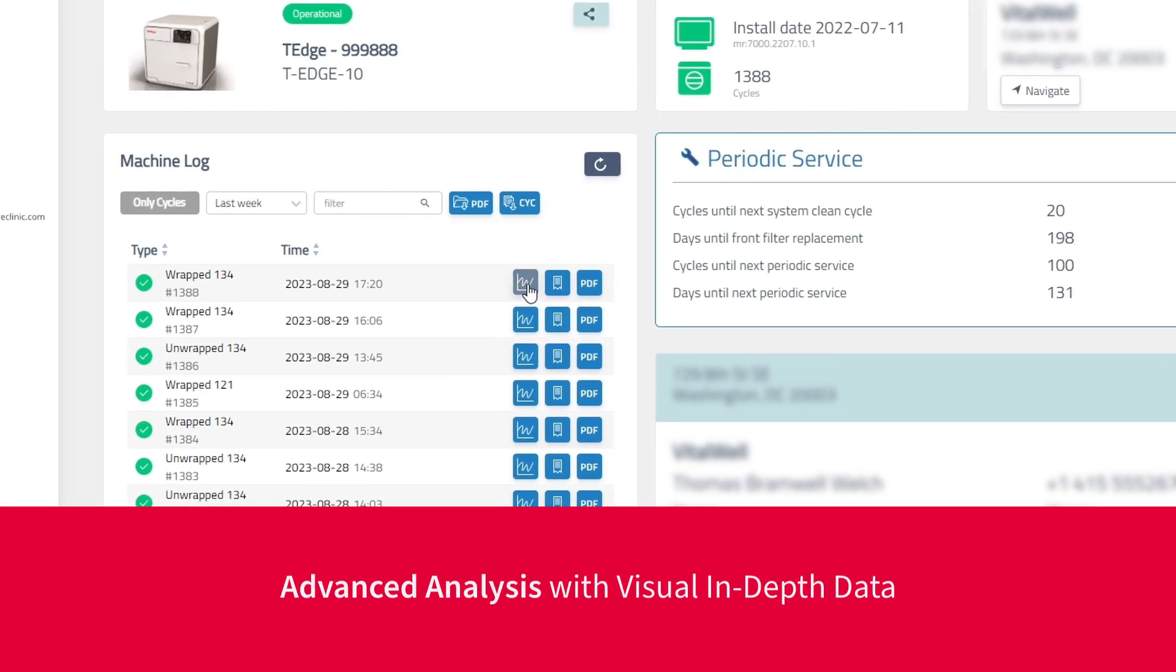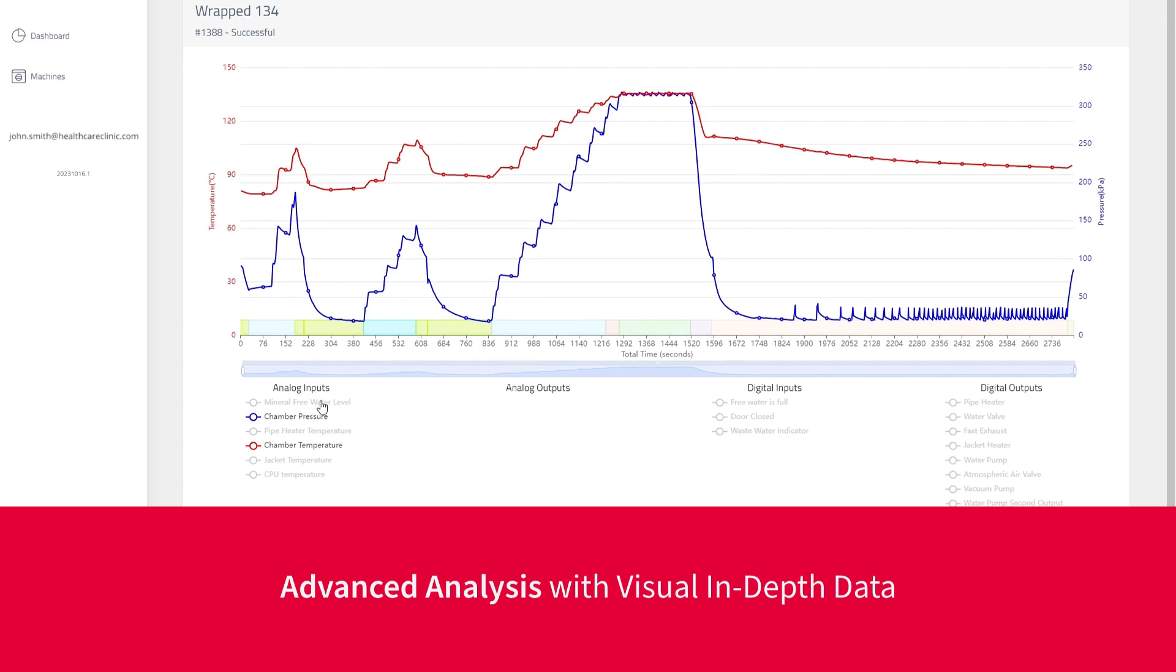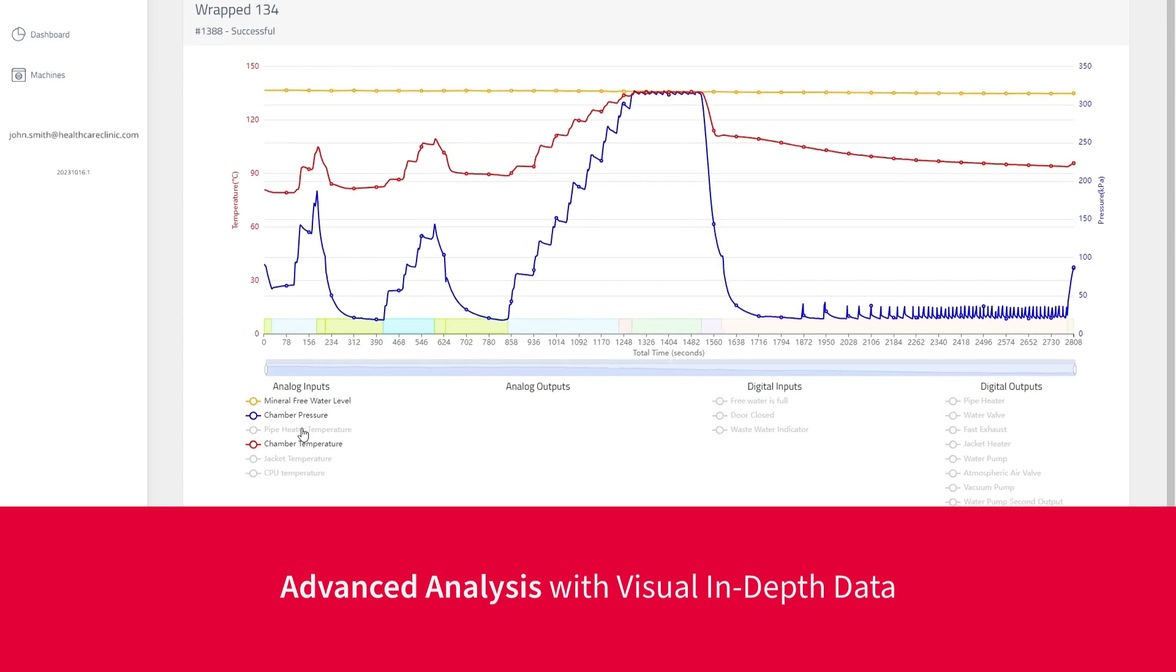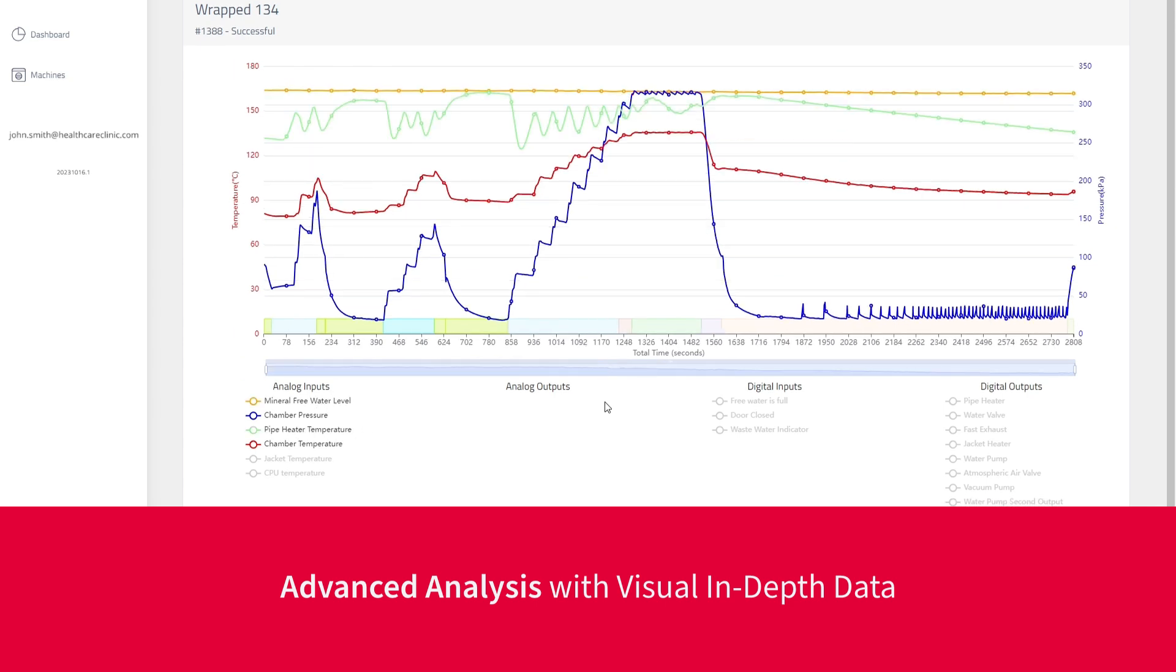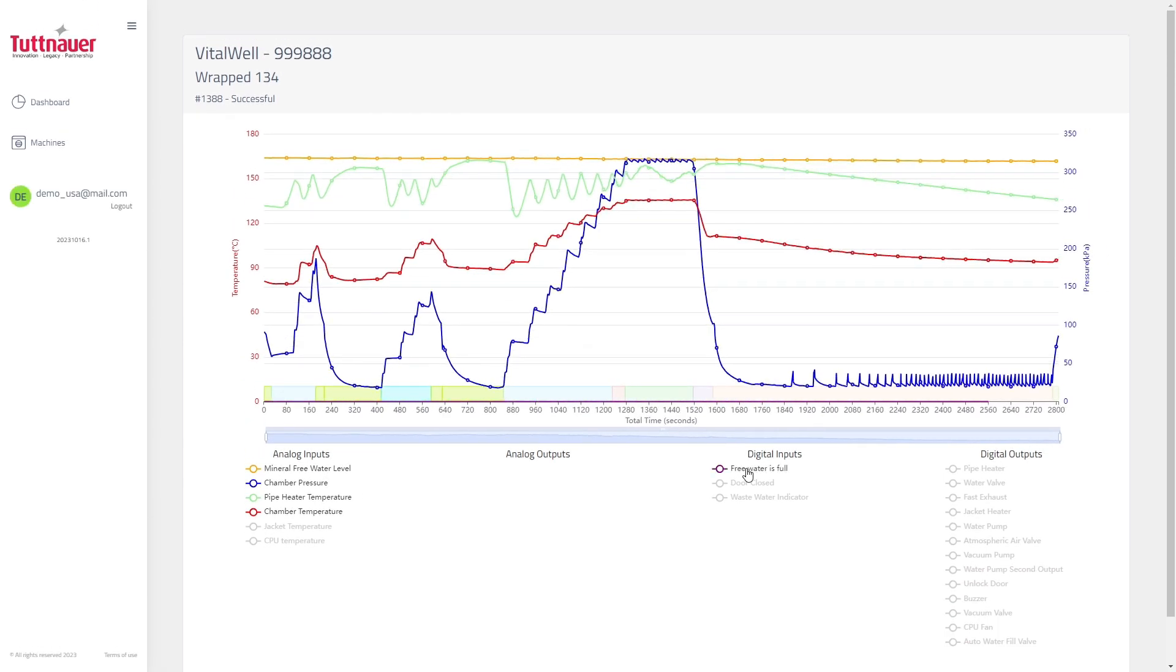Service providers could easily open detailed graphs to view each cycle's parameters during all its stages and correctly diagnose the machine.